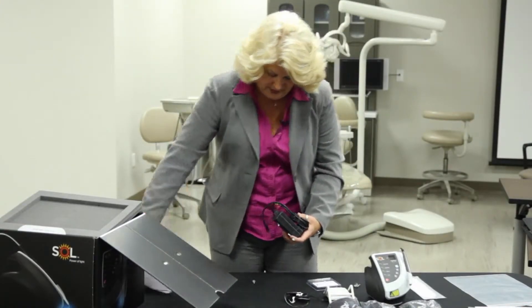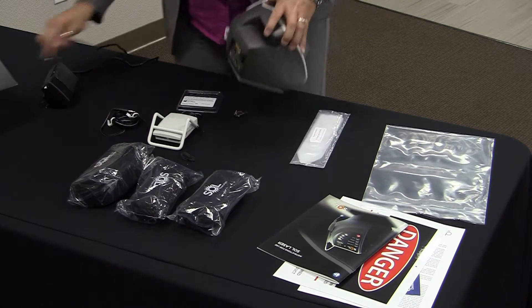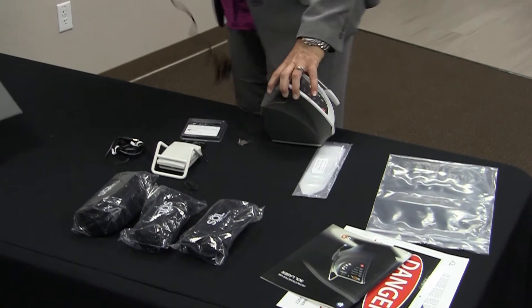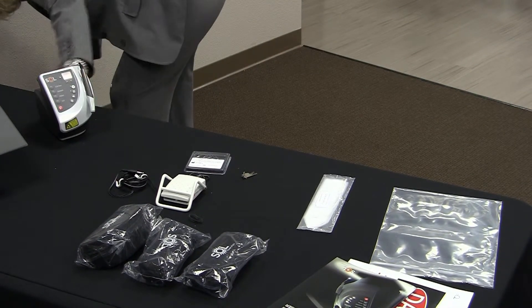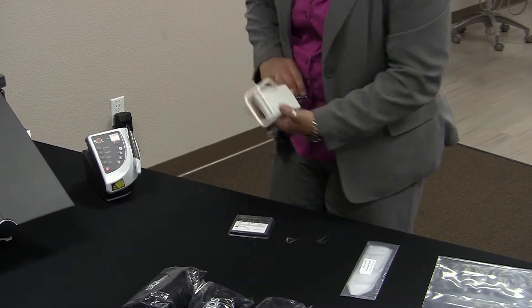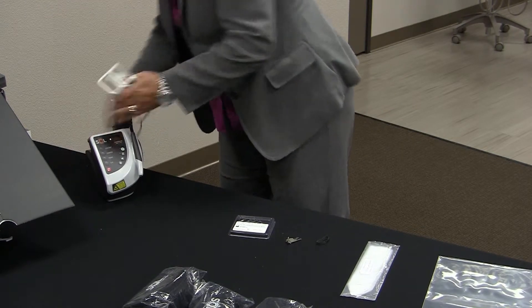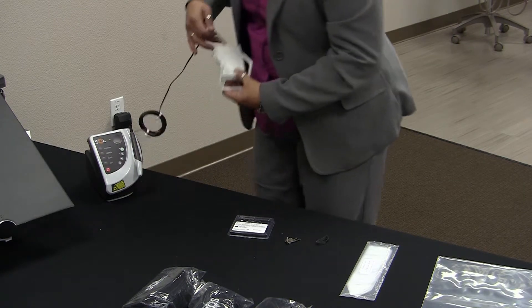So in here we are going to plug in our AC adapter cord that plugs in the back here, and then this plugs into the wall. We also have our foot pedal, which plugs into the back, and then you can take the foot pedal to whatever area you want it and unravel that.